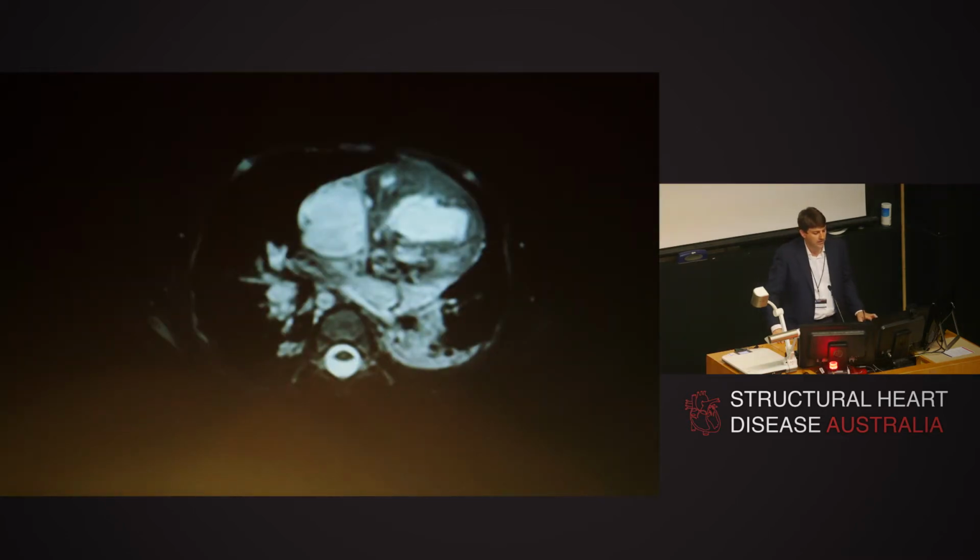Now, one thing to consider carefully is that you can't print what you can't see. So this is a zoomed up picture of a neonatal MRI of a patient with complex congenital heart disease. They've got a stenosis of a misplaced pulmonary valve here, and there's lots of black areas here and black areas here, and it takes a lot of expertise to work out what is artifact and what is real, and where exactly all the anatomical structures are.